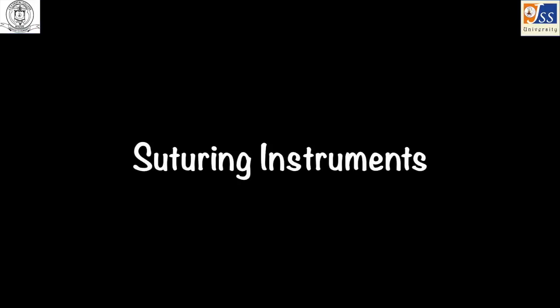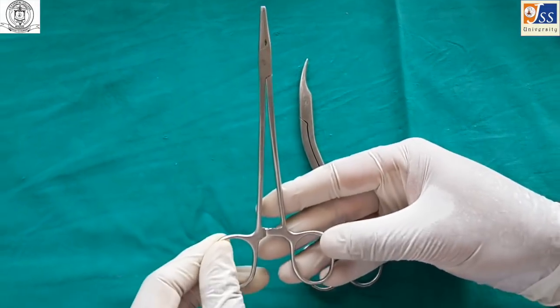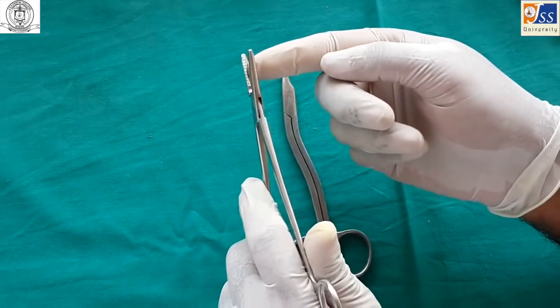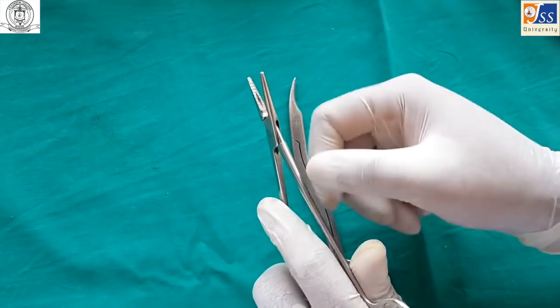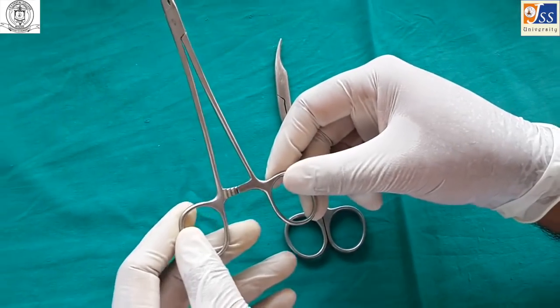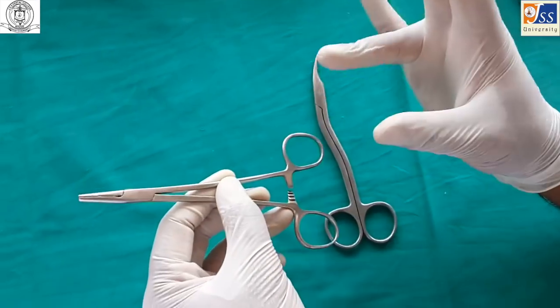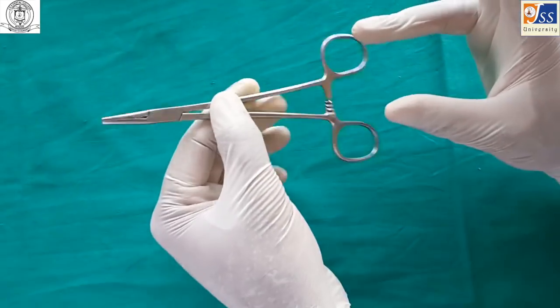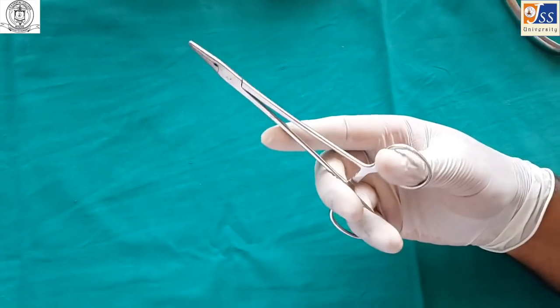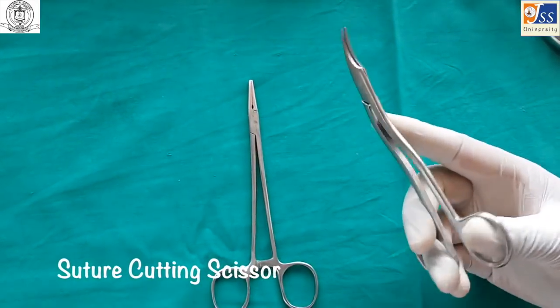Suturing instruments consist of a needle holder and scissors. The needle holder is identified by criss-cross striations on the inside and is a latched instrument. It is held with the thumb and ring finger, with the middle finger for support and forefinger for direction. A suture cutting scissor is used after suturing and for removal of sutures.